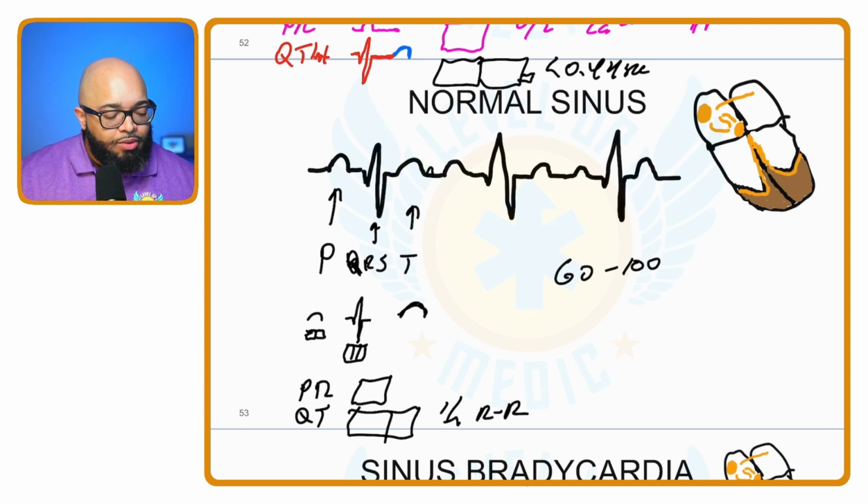What happens if this T wave, for instance, is peaked? Okay, that's often indicative of hyperkalemia. So we've got elevated potassium. Well, what is potassium normally supposed to be? Remember, we covered all this already. What's potassium? Some books will say 3.5 to 5. Other books will say 3.5 to 5.5. But what I want you to know is definitely greater than 5.5 is indicative of hyperkalemia.